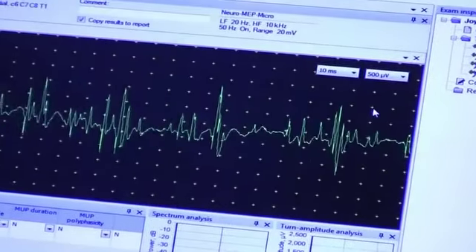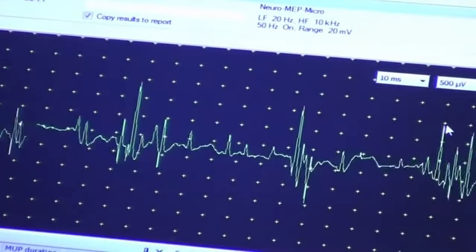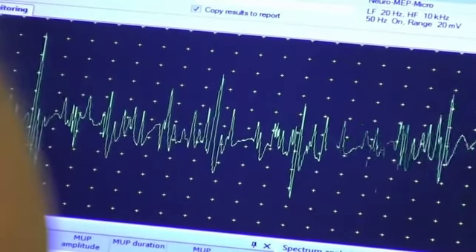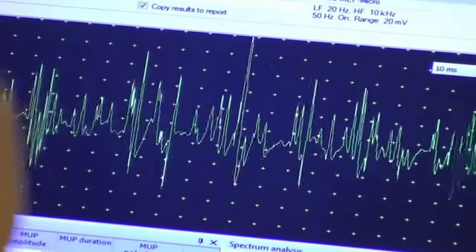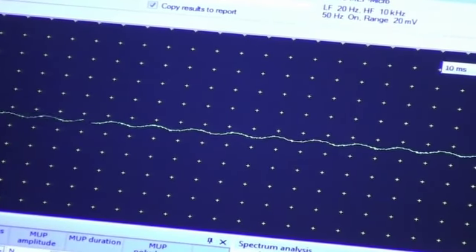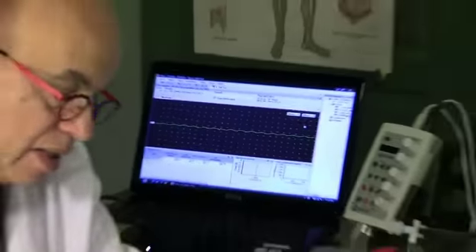And here are the motor units. This is moderate activation. I'm looking at different motor units. Push up against my hand all the way, all the way. And this is full activation. So now the muscle is fully activated and it's perfectly normal. Now I'll take it out.